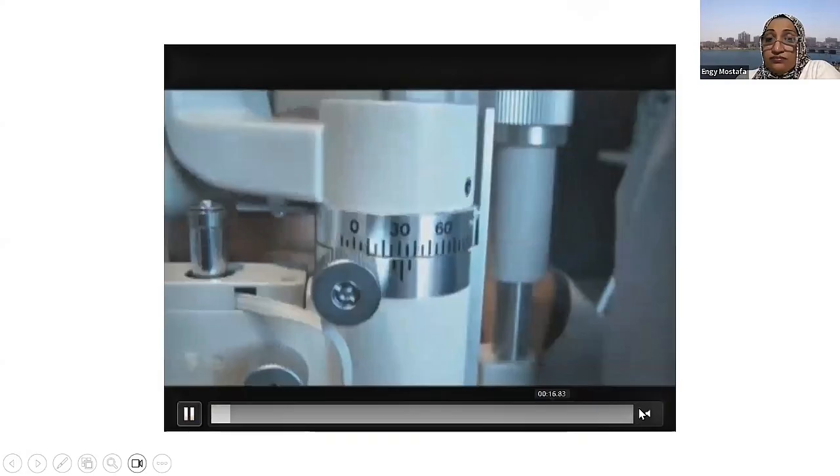So to make it more obvious, we are looking for the inner touch of the two half circles, of course. These are the skills that should be taught here. One more thing to remember, that's called tilting. See, there is a knob that you can tilt in your device here so that you can decrease the amount of light entering the eye, especially in photophobic patients.